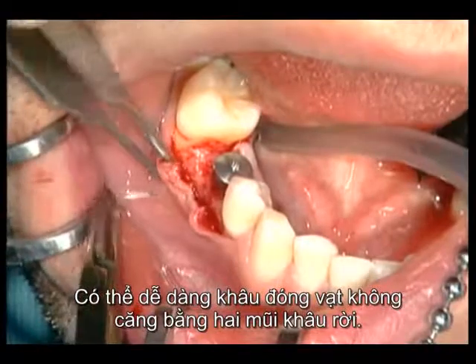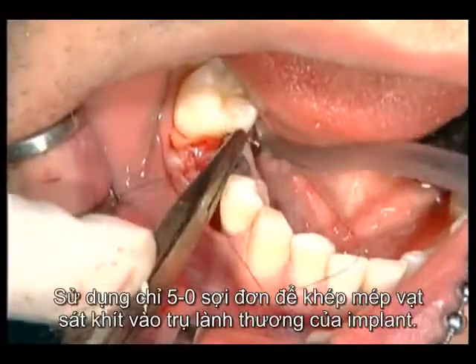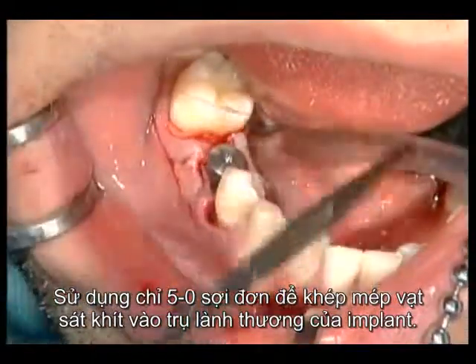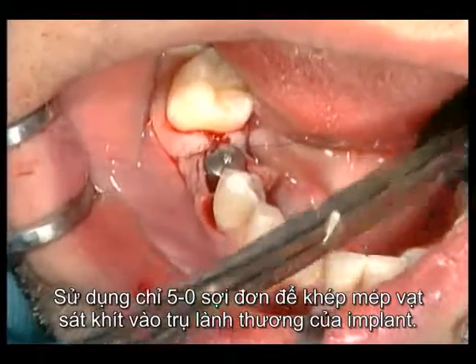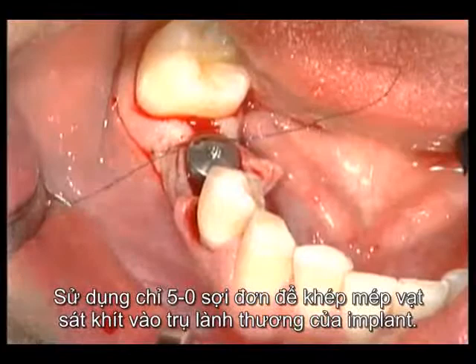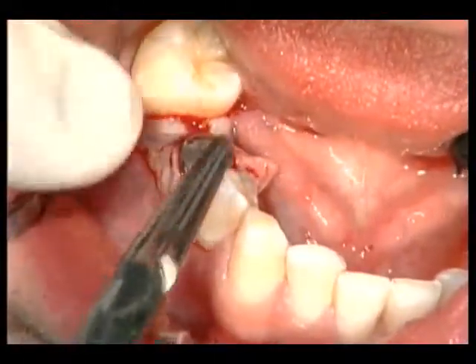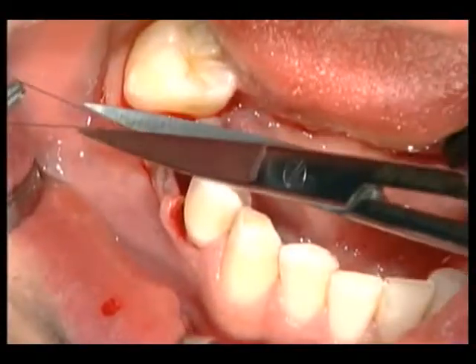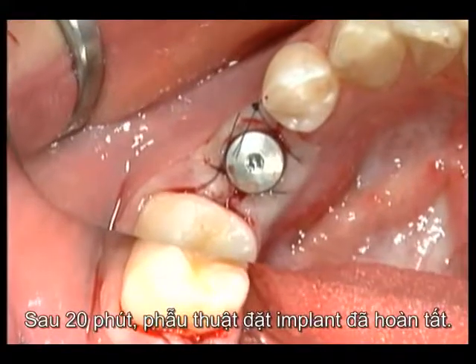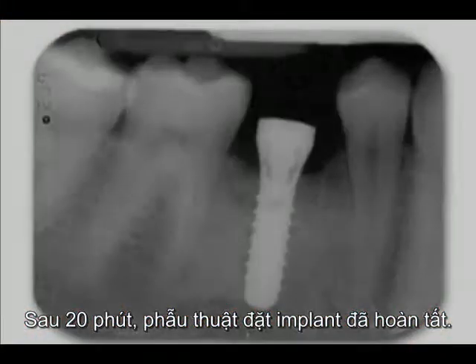The tension-free wound closure can easily be done with 2 interrupted sutures. A 5/0 monofilament suture is used for close adaptation of the wound margins to the implant healing cap. After 20 minutes, the implant surgery is already completed.